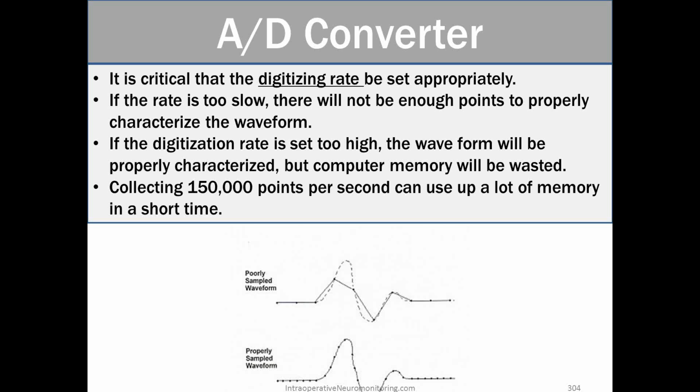So here we have pictures saying not enough sampled points, and one that's a proper amount of sample points. You can see when we don't have enough sample points, we lose part of the information that we're actually trying to assess.